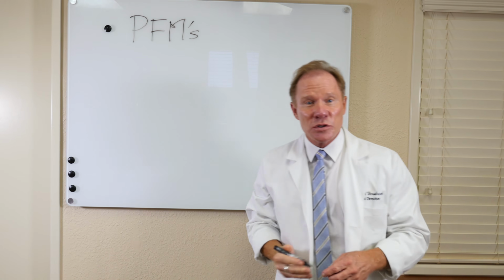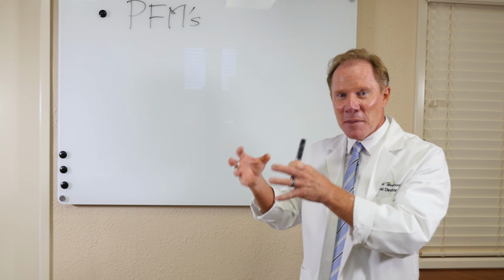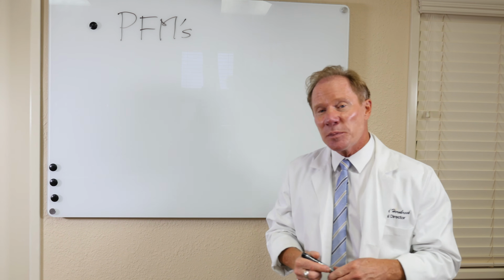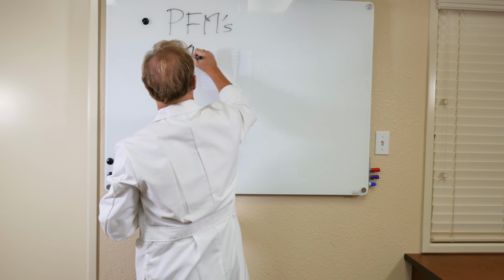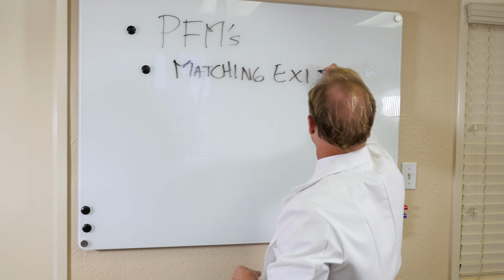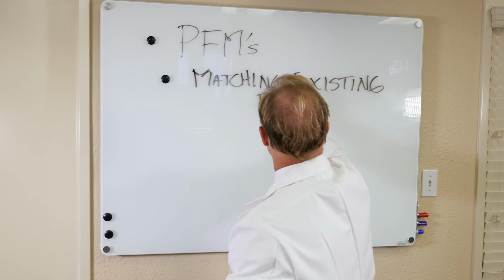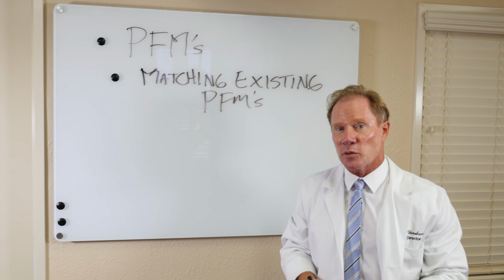Now, although their use has certainly decreased with time, it's still a major player in the indirect restoration world. Where would I use a PFM? Well, honestly, I don't use it very often, but where I would is matching existing. So let's say a patient comes in and has PFMs on the anterior and they break a front tooth, and you have to replace a single restoration or maybe a bridge next to single restorations.